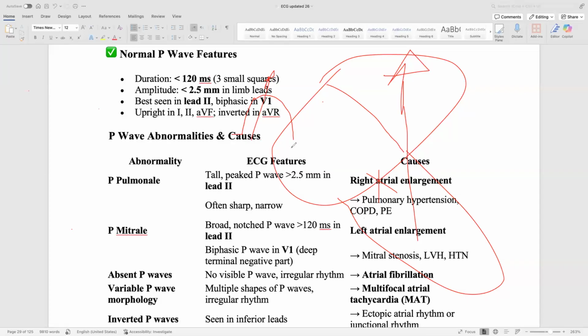Now we are going from the lead to the diagnosis. If we find a large P wave in lead 2, it tells us, I am a large right atrium. Come here, why are you large? I am large because I am pumping blood against a stiff ventricle. Why is the right ventricle stiff? Because the artery where I am pumping the blood has high pressure.